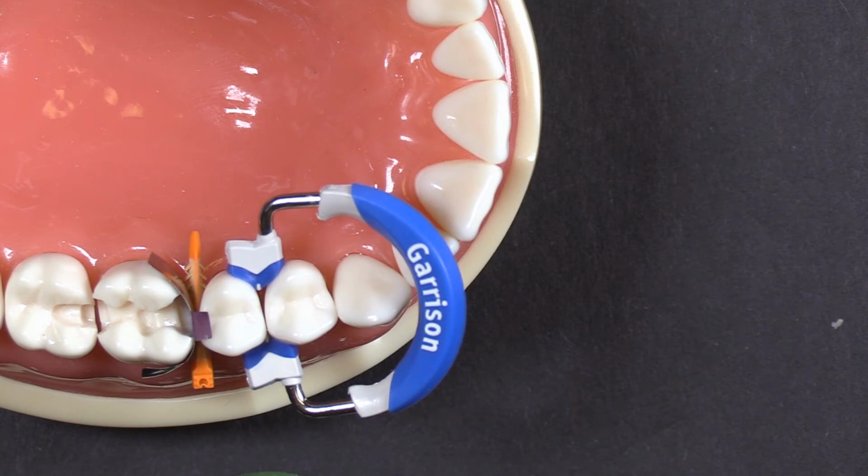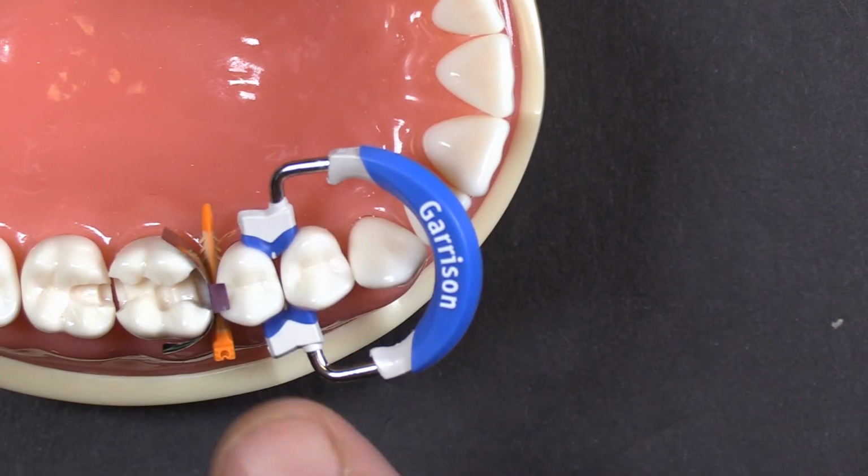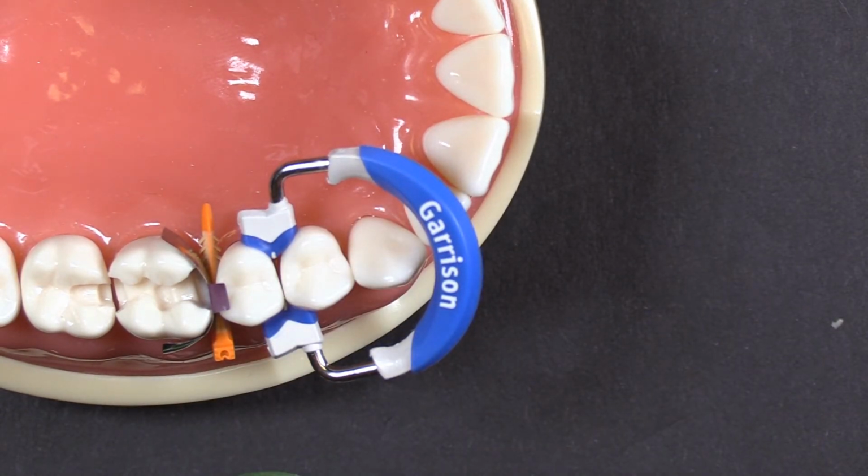So we talked about the too tight a contact, what to do if it's too tight. One of the reasons you can get them too tight is that every patient that sits down in that chair is going to be a little bit different. Some of them are going to have a little bit more mobility to their teeth, and the combination of the ring and the wedge is going to create more tooth separation, and the resulting contact is going to be tighter.